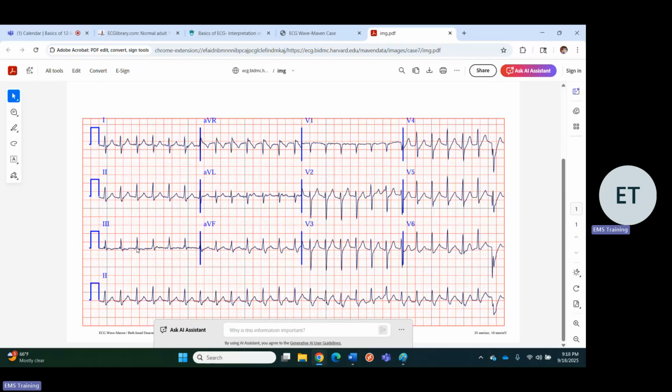There are some slurring effects that happen sometimes with AVNRTs. You're trying to think, is it an AV nodal reentrant or non-reentrant, or non-AV node atrial tachycardia? I don't really see P waves. Sometimes it's tough. Sometimes a 2-to-1 A flutter can look almost like an SVT with a relatively non-variable rate. That looks weird. I wonder if that's an artifact. Well, there it is again and again. But it's not there. Is there some sort of AV node dissociation going on?